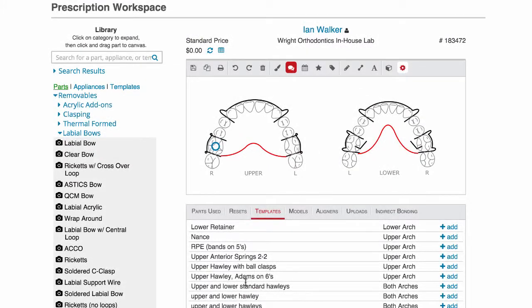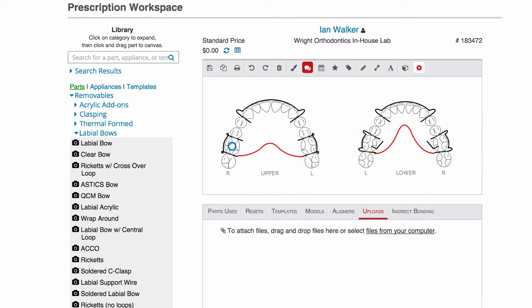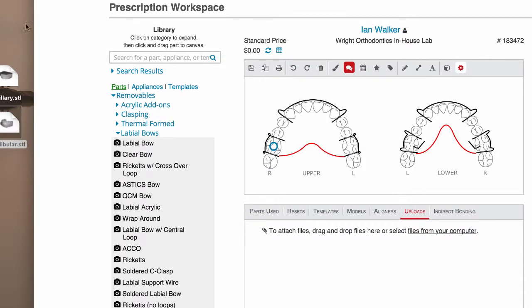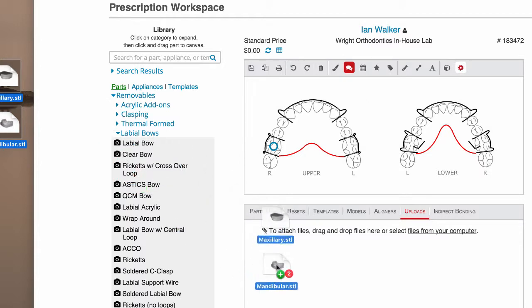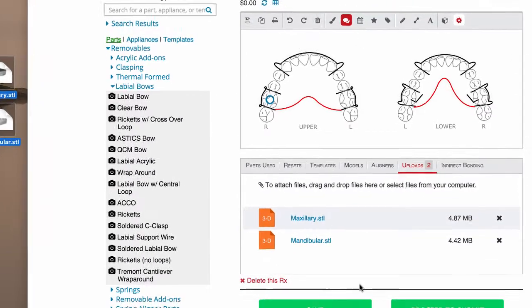EasyRx gives your practice the ability to customize your color chart based on the colors you offer. If you are 3D printing arches directly in the office, it's best to attach 3D STL files directly to the prescription. Click on the uploads tab and drag your exported STL files directly into the RX. We take care of all the storage and backups, keeping all your patient data safe and always available.